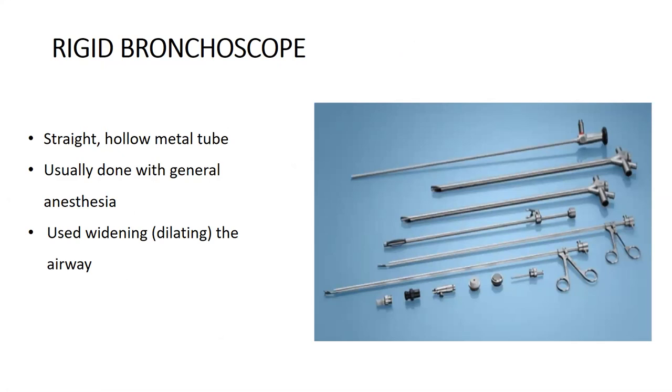Okay. Definitely. And any major question from the PGs? Sir, I have a question. In people with aspiration pneumonia, how much quantity do they really aspirate for it to cause aspiration pneumonia? Because while using the bronchoscope, we do a lot of bronchoalveolar lavage. So what is the maximum cutoff for saline that you would use to prevent that? Is there any value, or is it just random?